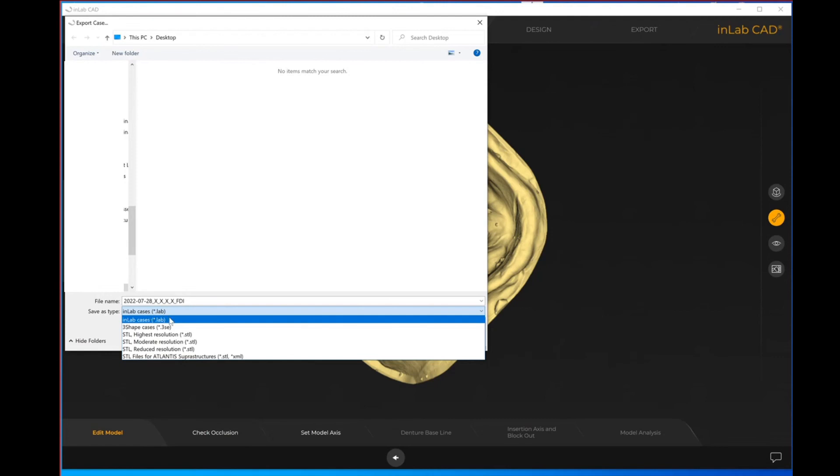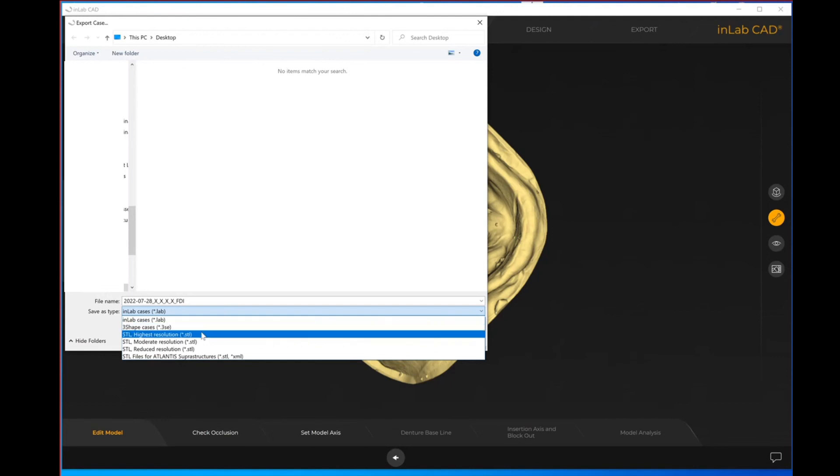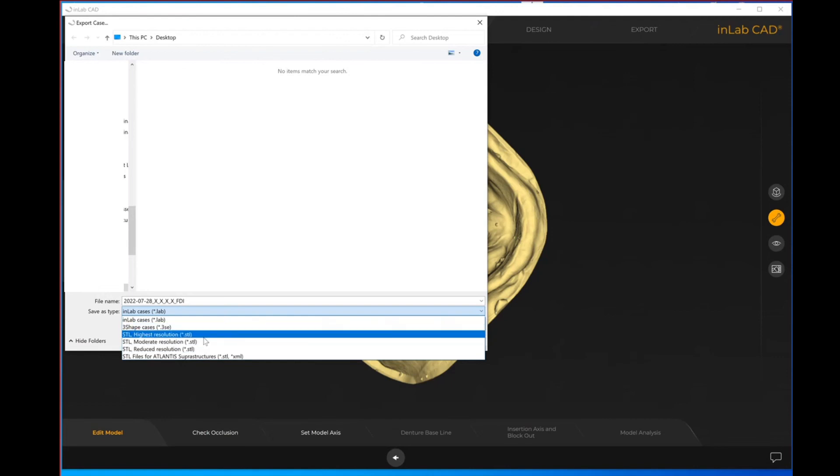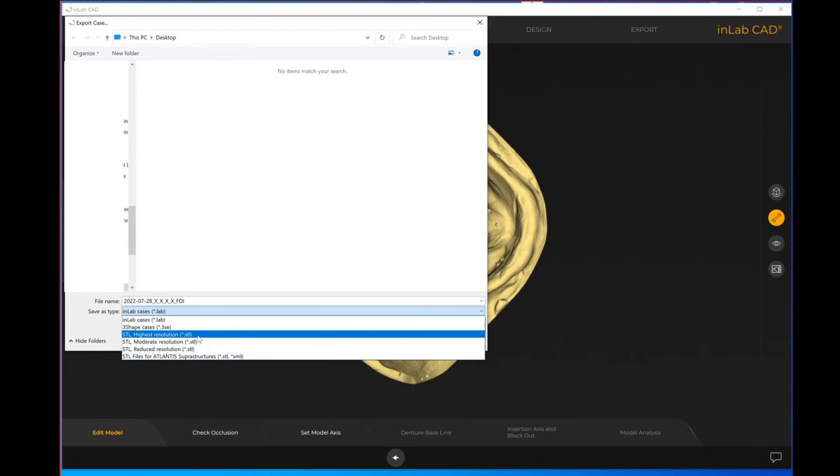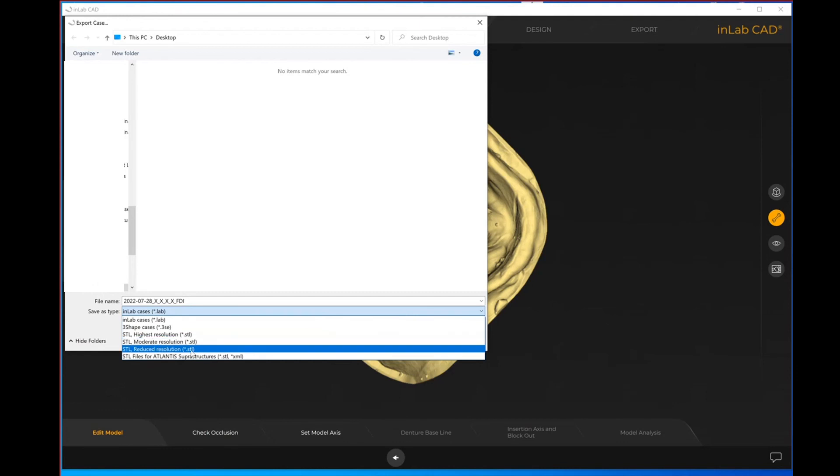When you do export, you'll see here that under save as type we have several cases to be able to export. Dot lab file, that would be if you are sending to another inLab user. You can export as a dot 3SE file for 3Shape. And then STLs, we have three levels of STL: STL highest resolution, I always recommend using that, STL moderate resolution, and then STL reduced resolution.